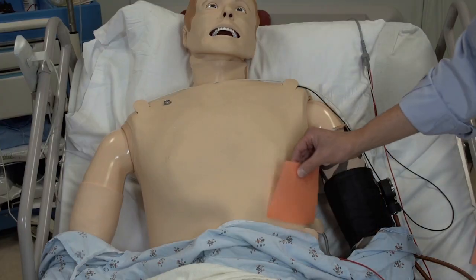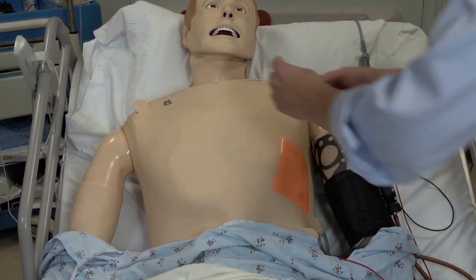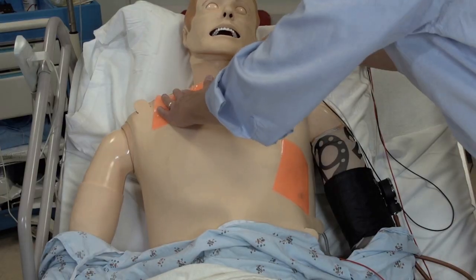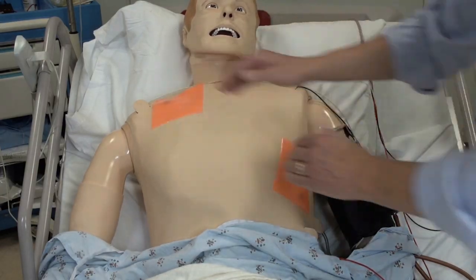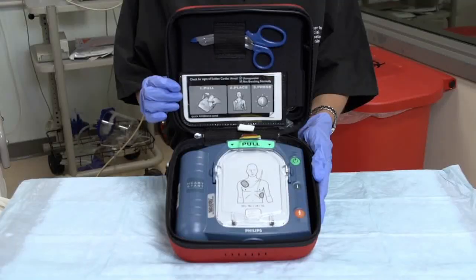If using a manual defibrillator with paddles, you must place conducting material between the paddles and the chest to avoid skin burns. Use either a conducting gel sheet or liquid gel that you place on the paddles. With an AED, turn it on and follow the on-screen prompts. Be sure that no one is touching the patient when it is time to deliver a shock.